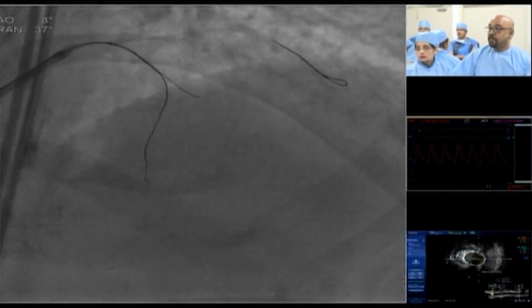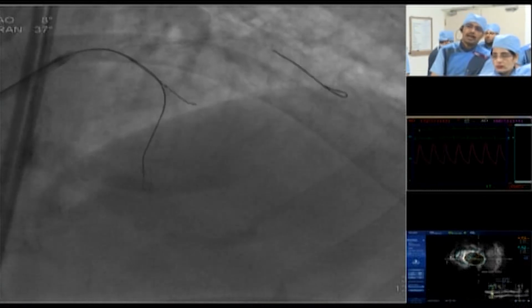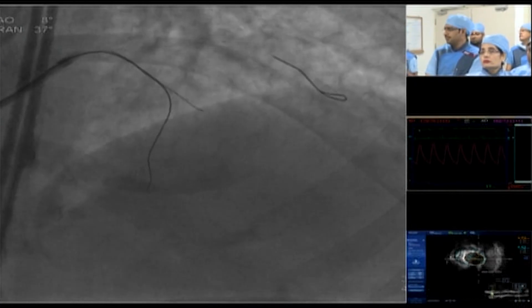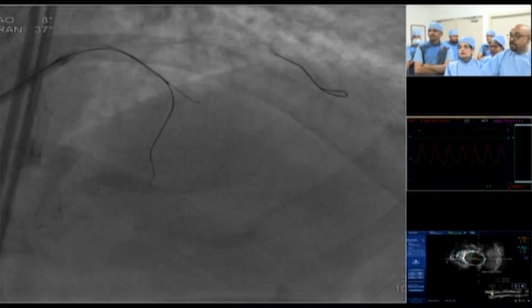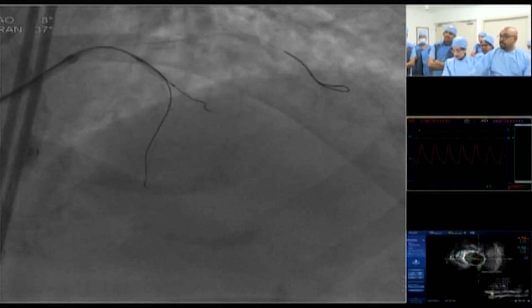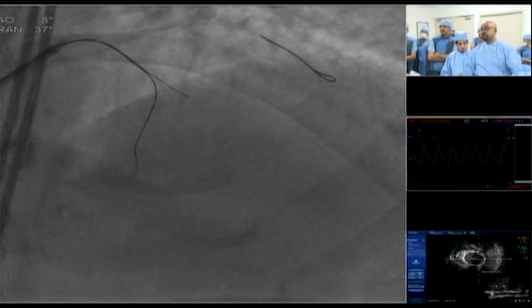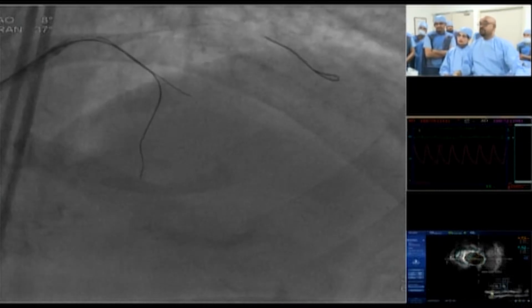No, both edges were okay, sir. This distal edge has a very minimal plaque burden. I understand. For the sake of everybody, I'm just mentioning that there were no dissections. That's well taken, but for the sake of everybody, I'm mentioning that when you're ending in a mild disease segment, we need to be careful, avoiding too high pressure inflations and taking the optimal size stent. Now we're going on to the next step.